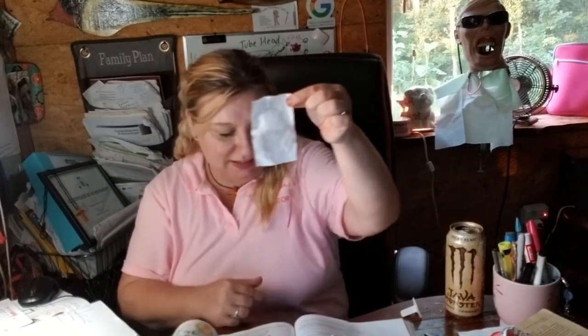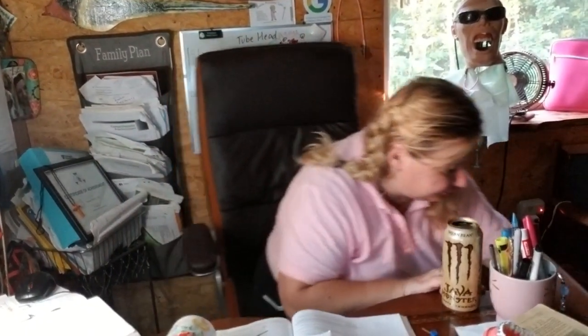And then you go. You're not going to take it out. You go like this. Alright, so tell them, I have to take 2 pictures. And one's going to go here. And then the little camera's going to go here. And I'll show you when it comes out. And then after you gently bend it back and you develop it, you'll have the upper and lower teeth all in one size 4 film. Okay, makes sense? Or you can do 2 of these. One here and one there. Okay, and throw that away.